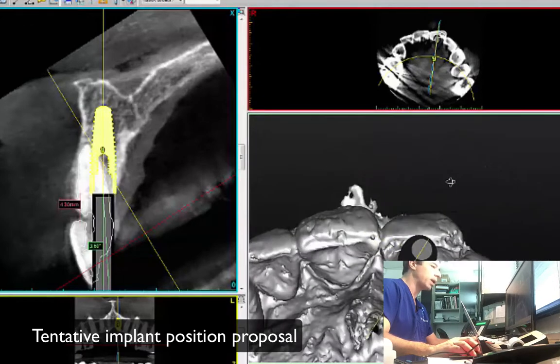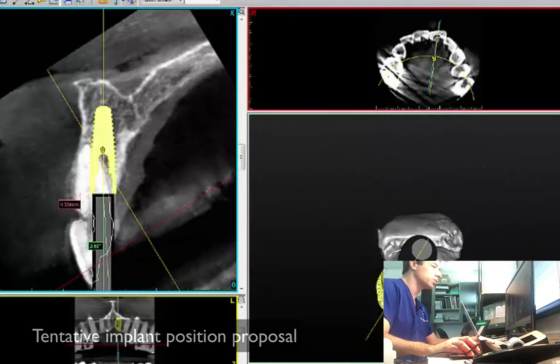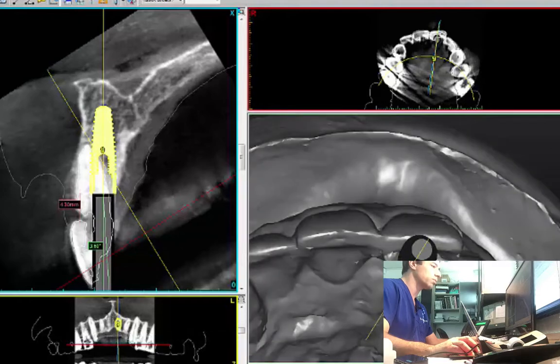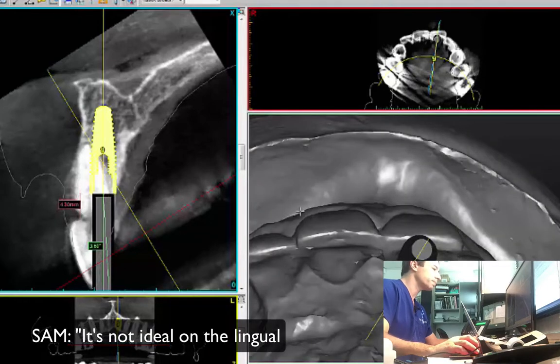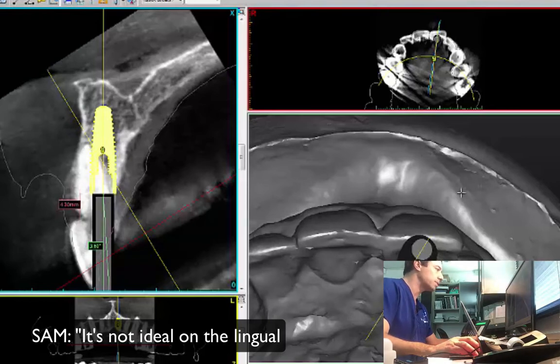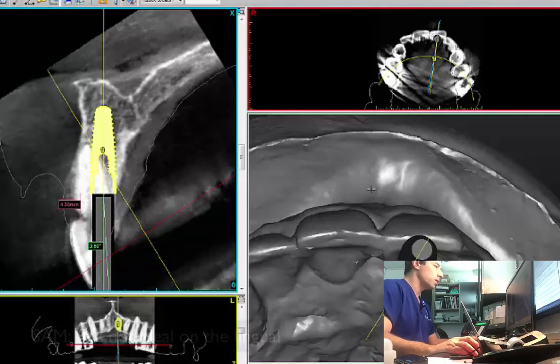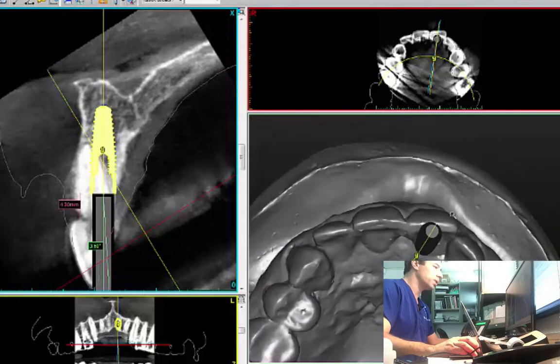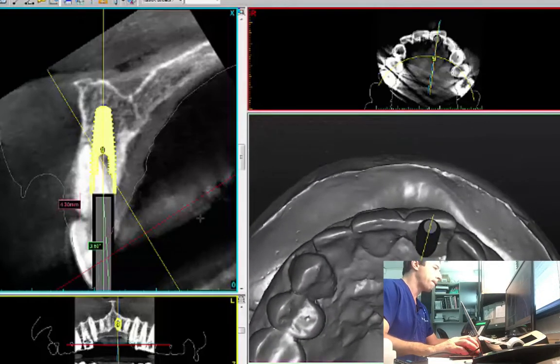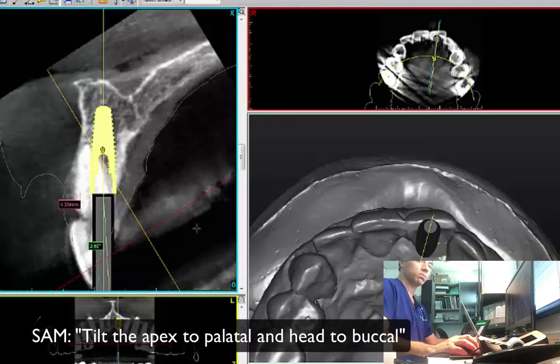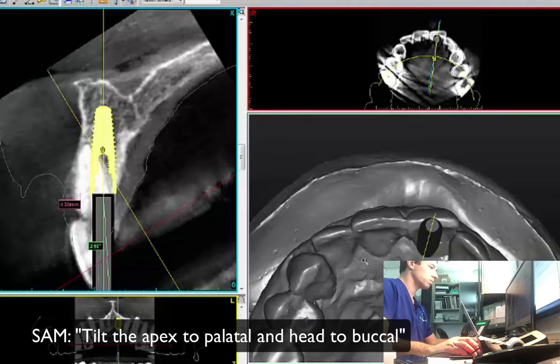It's probably not ideal at the moment. That's why I wanted to just run it by you. It's not ideal on the lingual wall — not ideal at all. But let's finalize it. So you want it to be a little bit more mesial? More distal? No — first thing, just apically tilt the implant to be more lingualized, and the head of the implant more towards the buccal.